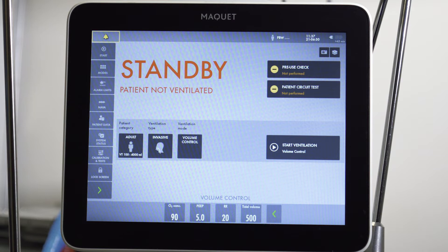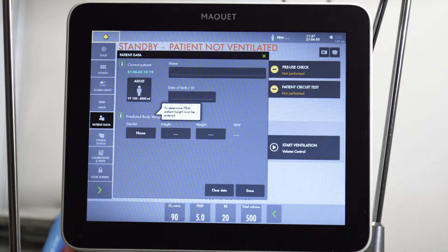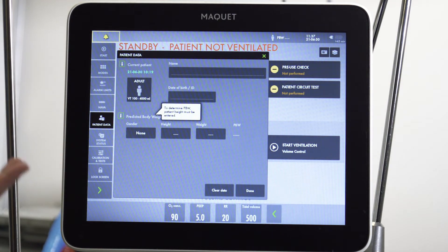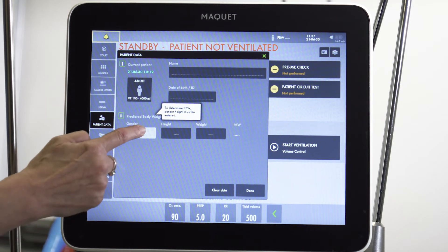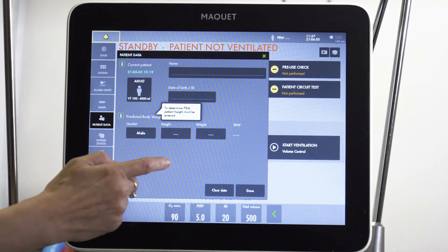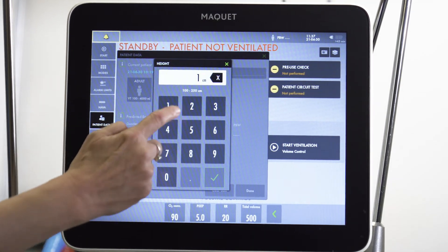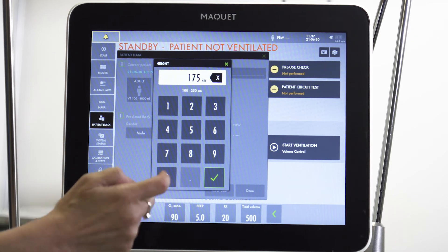One of the first things that we want to do is set a predicted body weight. In this example, we have a male, and the average height is about 175 centimeters.